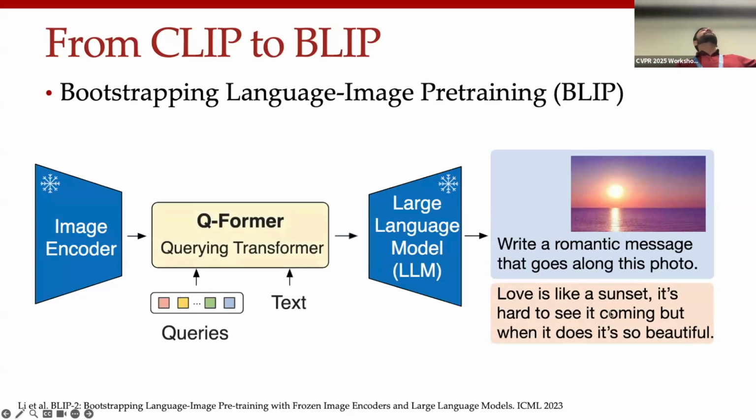And we're just training a little adapter module in the middle. And this adapter module could be as small as a small two-layer multi-layer perceptron. And we can reuse a lot of these pre-trained components, which have been aggregated already, to solve this language generation problem. So we really wanted to leverage this specifically for medical imaging.